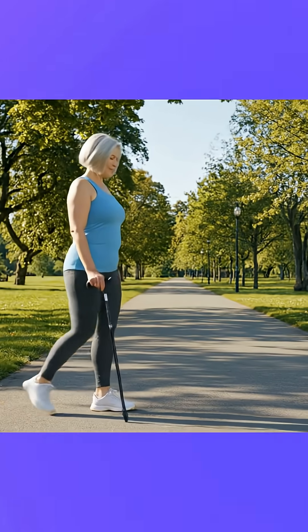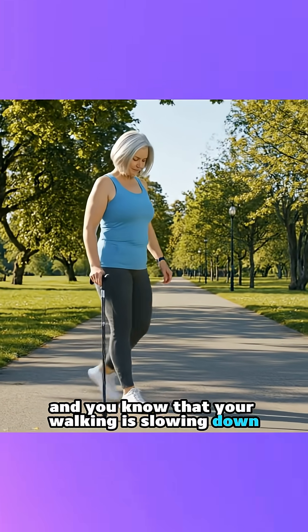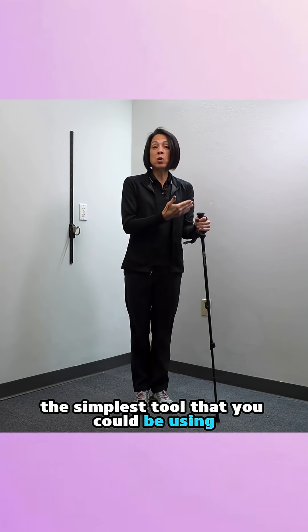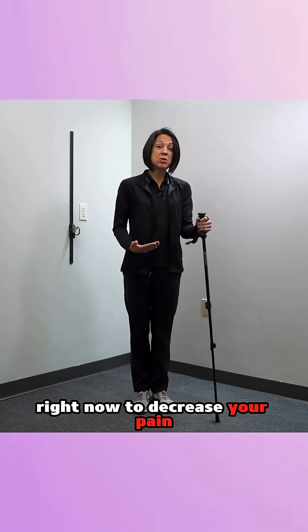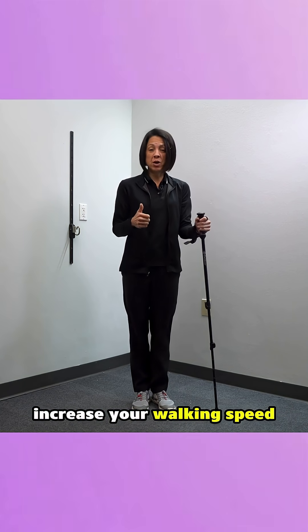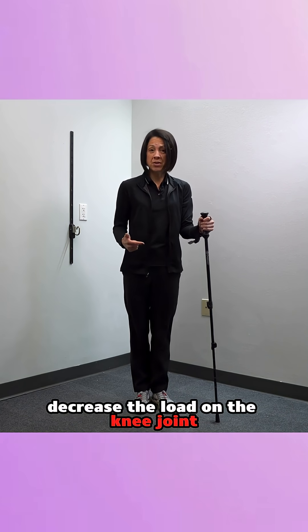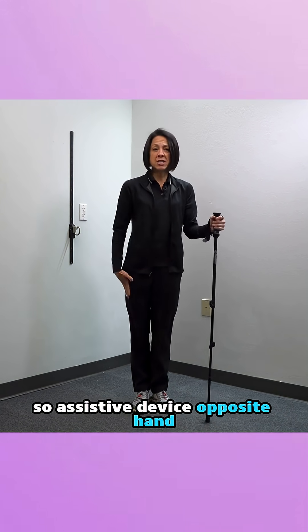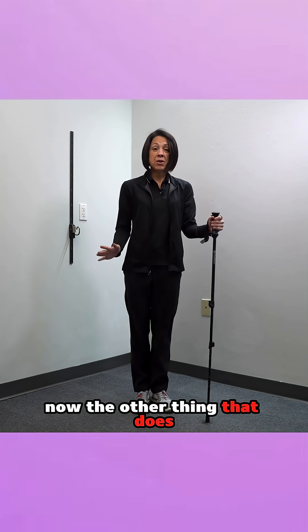So if you are hesitant to use an assistive device and you know your walking is slowing down, just be mindful that it could be the simplest tool you could be using right now to decrease your pain, increase your walking speed, decrease the load on the knee joint, and potentially avoid surgery. So: assistive device, opposite hand.